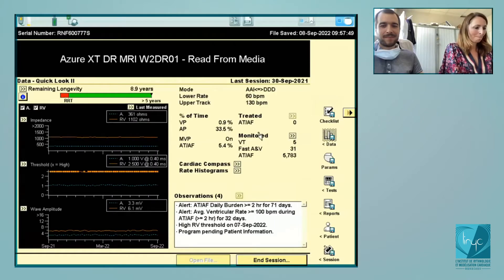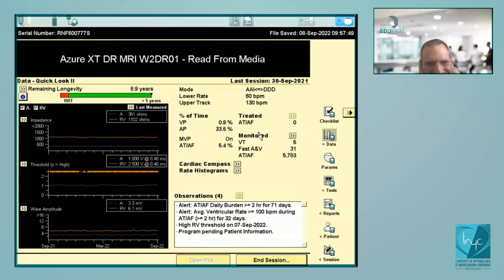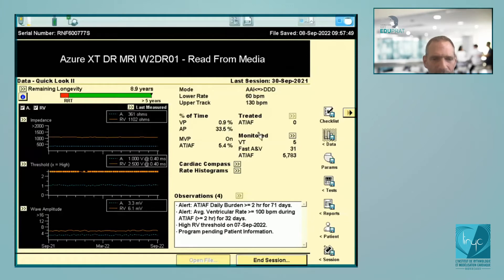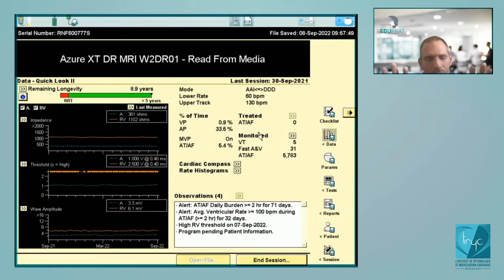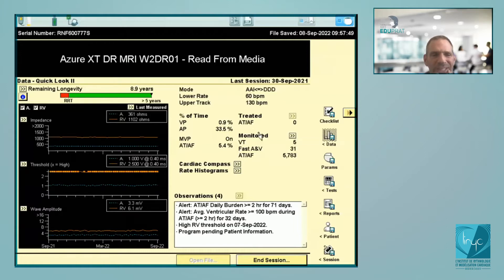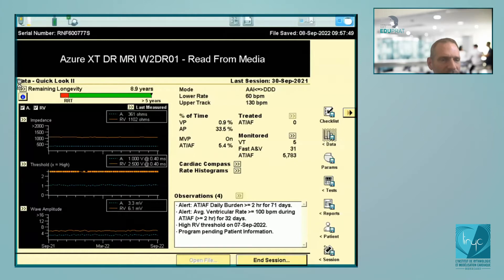Back to the first screen — the 'Quick Look.' There are of course some differences from one company to another, but the idea is that on this screen you need to have all the main information and all the links to get the different information during interrogation. The first thing I usually do is click on remaining longevity.